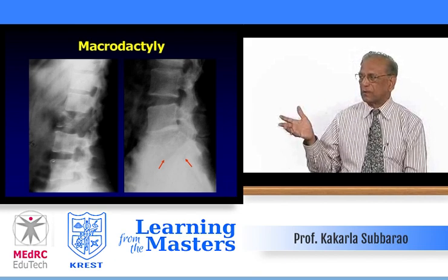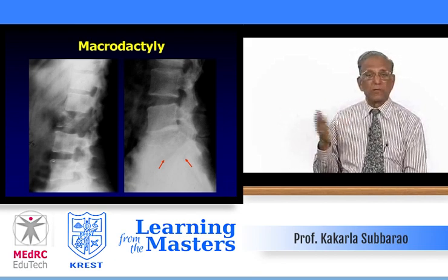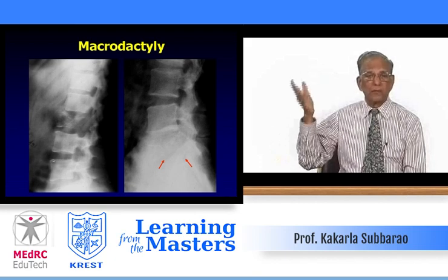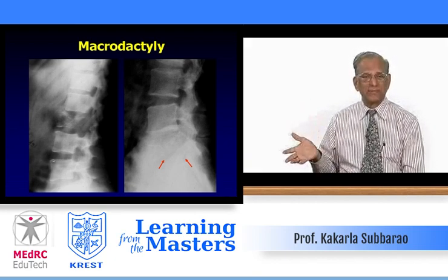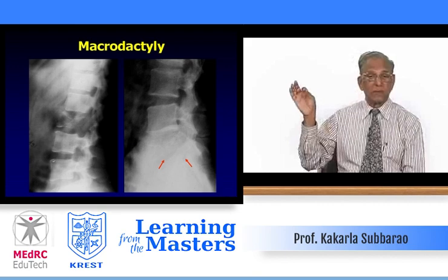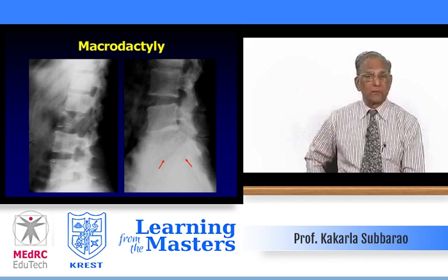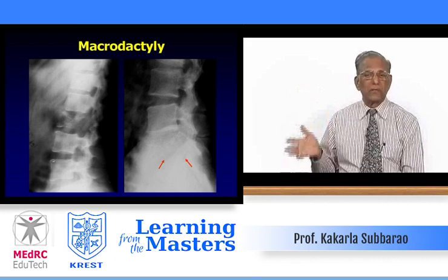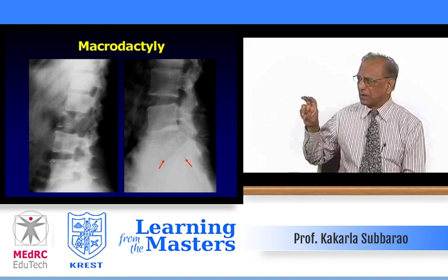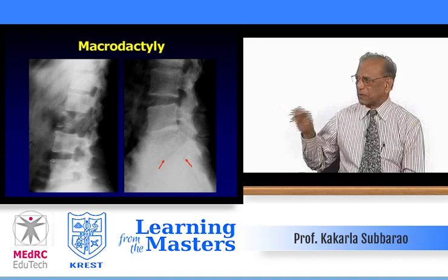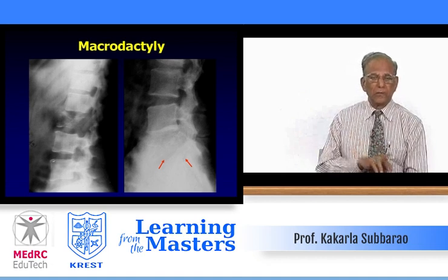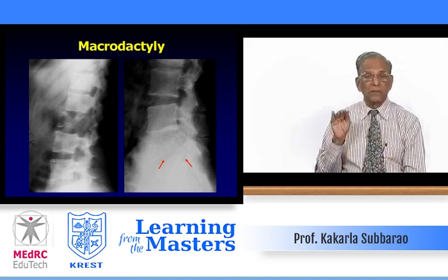Since the patient is more than 50 years old, it could be plasmacytoma. To differentiate from metastasis, you need a limited bone survey or better a radioisotope technetium-99 bone scan, where you can see multiple lesions. In myeloma, you may find cold spots, whereas in metastasis it is most often hot. On the right side, L5 is again lucent and expanding — this proved to be metastasis by bone scan. On plain film alone you cannot differentiate between the two, particularly when age is above 50.